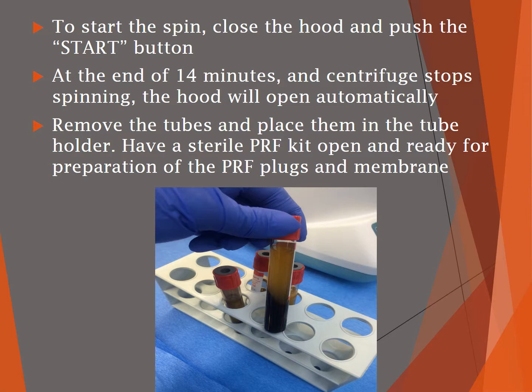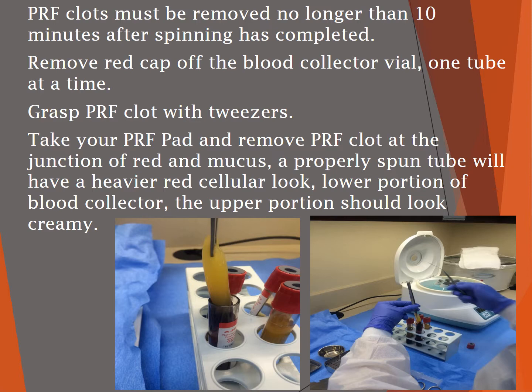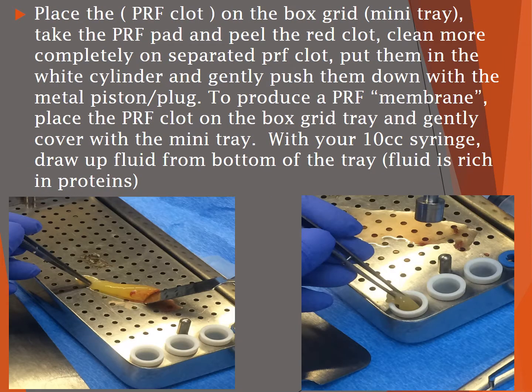Have a sterile kit open and ready for preparation of the plugs and membrane. The clots must be removed no longer than ten minutes after the spinning has been completed. Remove the red cap off of the blood collector tube one tube at a time. Grasp the clot with a pair of tweezers and use the pad to remove the clot at the junction where the red and mucus come together. A properly spun tube will have a heavier red cellular appearance at the lower portion and a creamier appearance at the upper portion. Place the clot on the grid box and peel the red clot using the PRF pad.